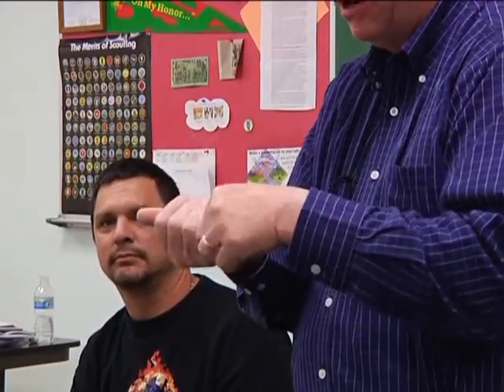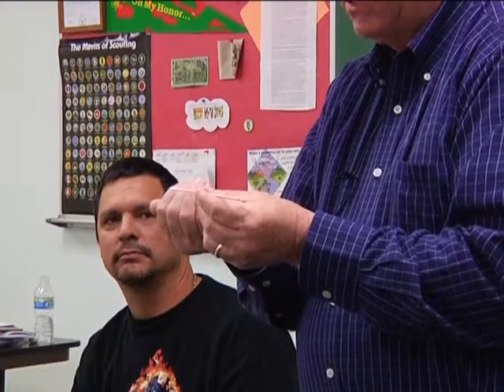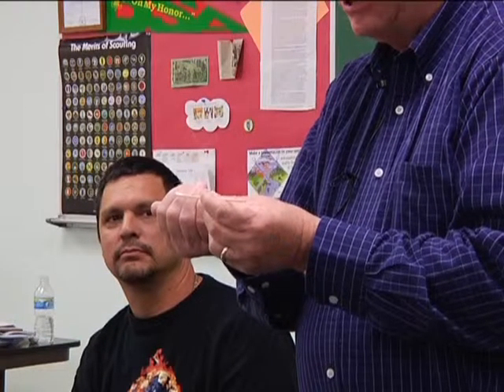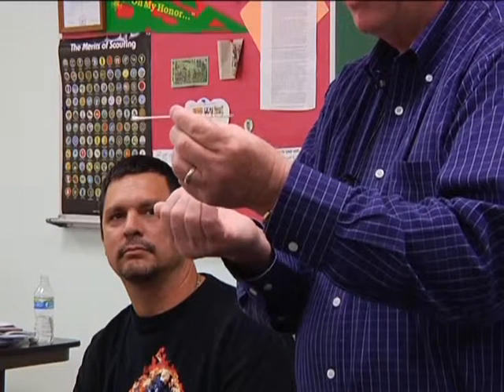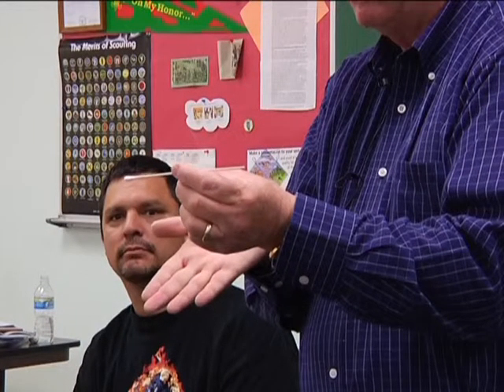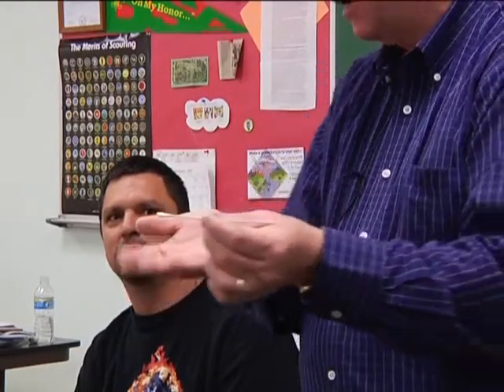You'll be able to see a little black dot here. Then take your Q-tip and roll it, and just very slowly and gently touch it to the little black dot, and it should just come right off on your Q-tip. Then flip the lid back down, and you're done. Painless, easy, quick. What's the black dot? A foreign body, a piece of sand or something. Yeah. So, okay.